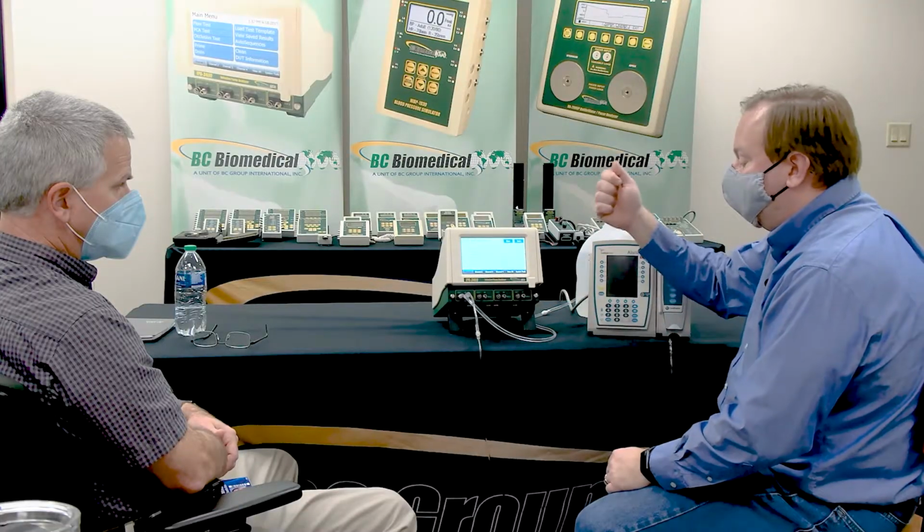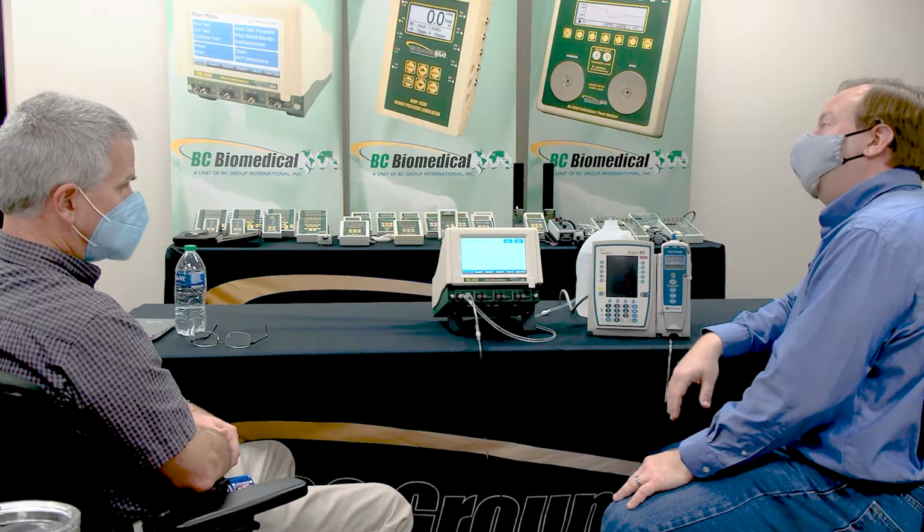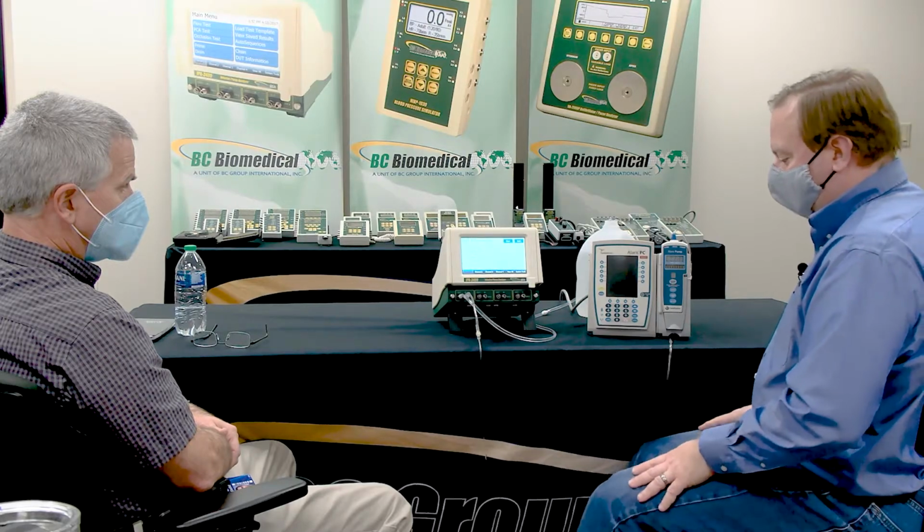Barcode scanners are just keyboards. It doesn't matter if it's a 2300, 2400, or 2400H. Anything that we have with a USB port takes it as a keyboard. If you can plug a keyboard in, you can plug a scanner in.